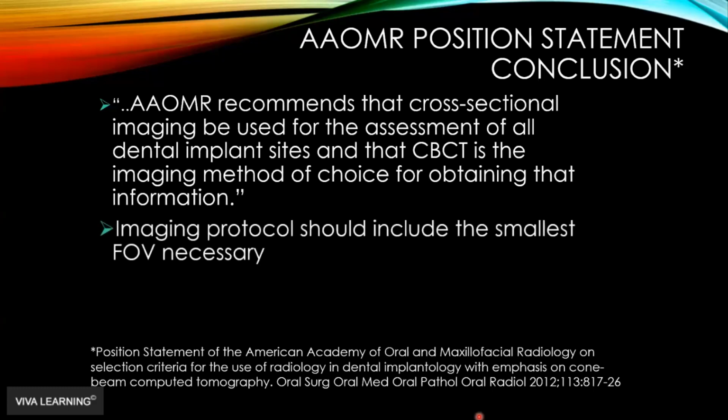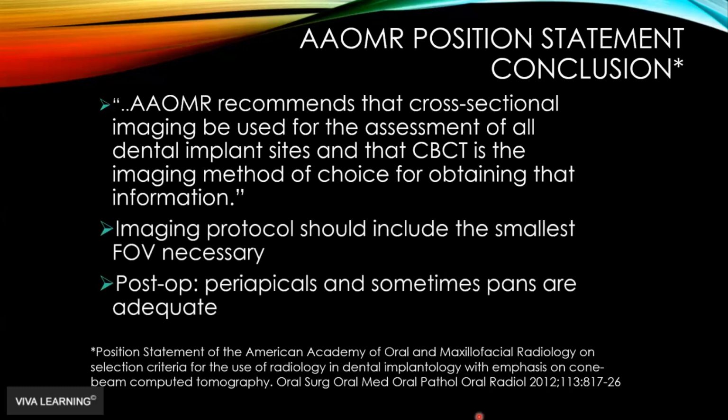And obviously the protocols, we talked about them: smallest field of view, lowest dose, diagnostically achievable. And then I also mentioned this post-operatively. If you're looking for osseointegration, rather than doing a cone beam, maybe a periapical is adequate, and sometimes PANS are also adequate because of the beam hardening artifact.